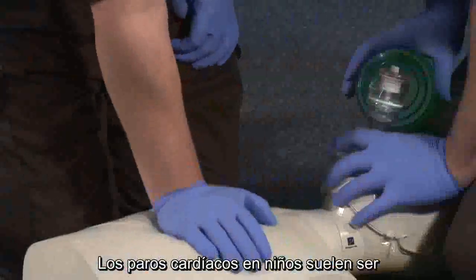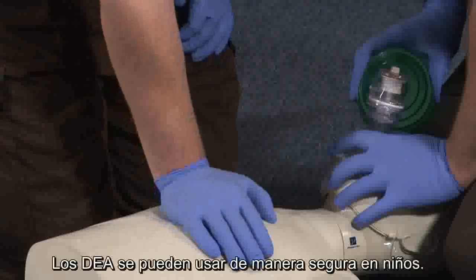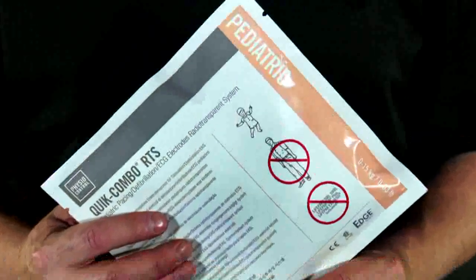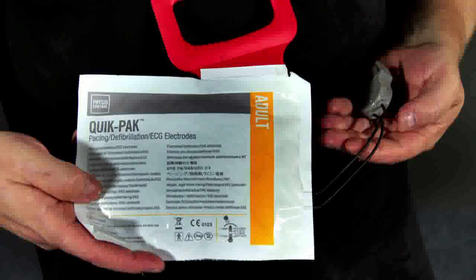Cardiac arrest in children is usually caused by an airway obstruction or breathing problem. AEDs can safely be used on children. If your device has specialized pediatric pads, use them. If such pads are not available, you should use the regular adult pads.